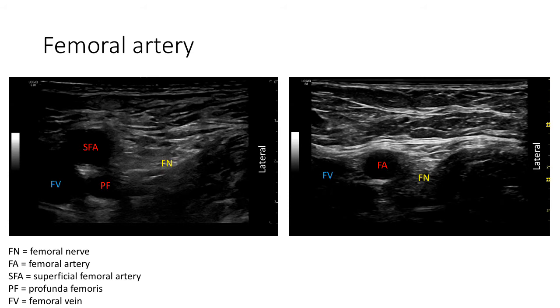The ultrasound probe is moved towards the head, or cephalad, until one femoral artery is seen, as shown in this right image. The nerve will be lateral to the artery below the fascia lata and iliaca, and a slight tilt of the ultrasound probe can highlight the nerve.